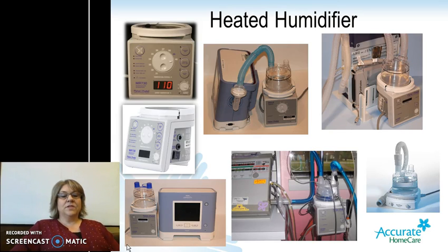There are several different types of models that are out for the heated humidifier. The most common brand that we see is the Fisher-Paykel. There are different model numbers of this brand, but they all work about the same way. Please get familiar with the Fisher-Paykel that you have in your home.